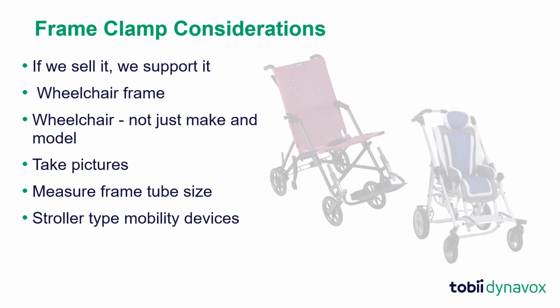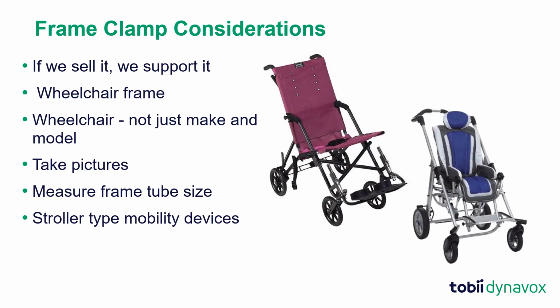A stroller-type chair may be considered mobility equipment, but we should not attach a device mount to it because the weight of a mount may tip the chair over. We cannot guarantee a stroller chair will maintain balance with a mounted device on it.